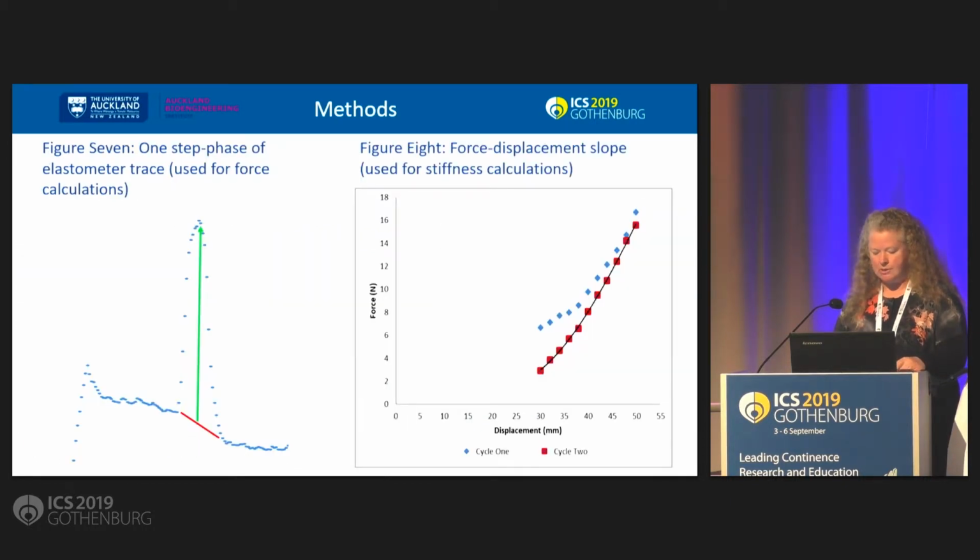For the force measures on the left side, the total force was calculated with a second order polynomial around the peak force. The passive force is calculated using the intercept line with the peak force on a linear trend line between the lowest values on either side of the MVC, and the active force is the difference between total and passive forces.